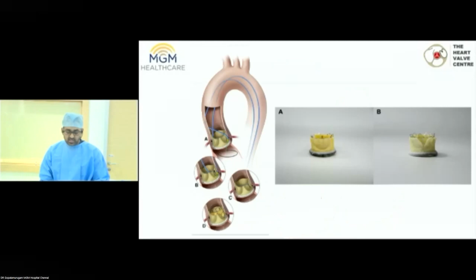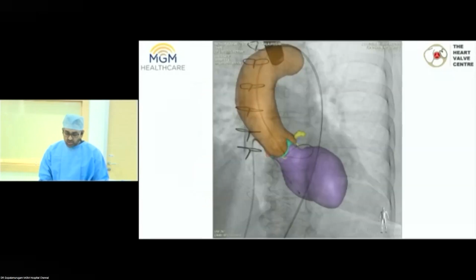And how do we do that? This is a cartoon to demonstrate, but we'll show you the real case. Here we have positioned the catheters. Basically, we need to cut off the left coronary leaflet of the bioprosthetic valve. We're not cutting it off, we're actually slicing it.